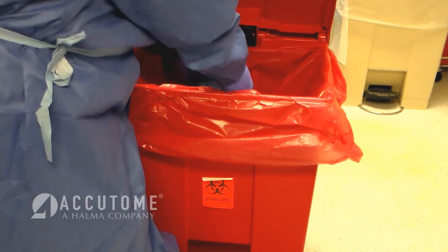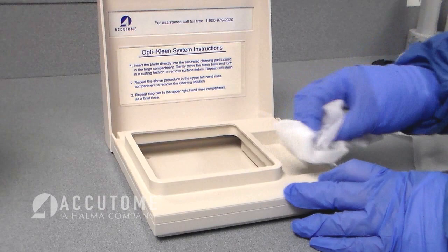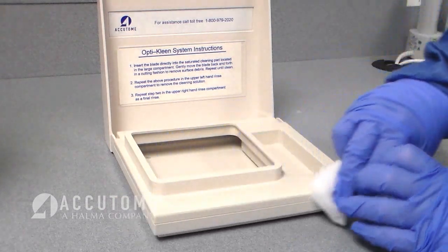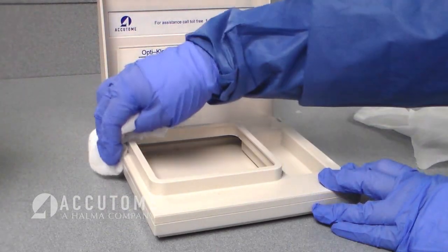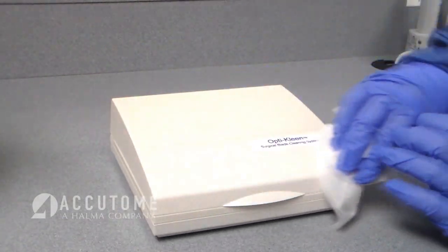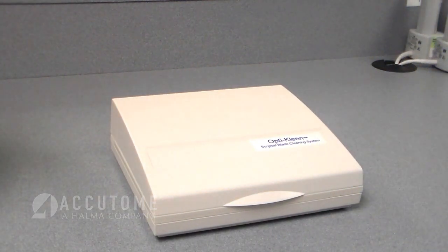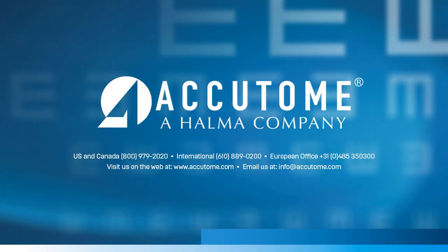Remove the OptiClean blade cleaning system from the holding tray and discard it in the proper waste receptacle. The Accutome OptiClean holding tray can be easily decontaminated with a disinfecting wipe at the end of the day. A separate wipe should be used for cleaning the outside of the holding tray so as not to cross-contaminate. Please feel free to contact your Accutome representative regarding any questions.